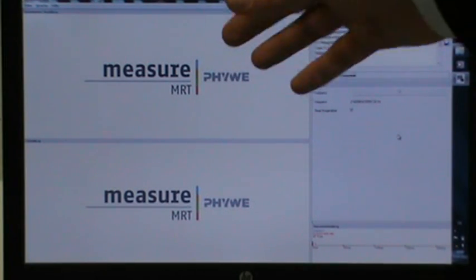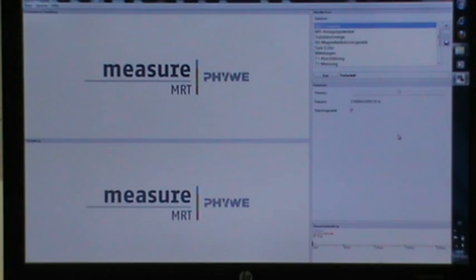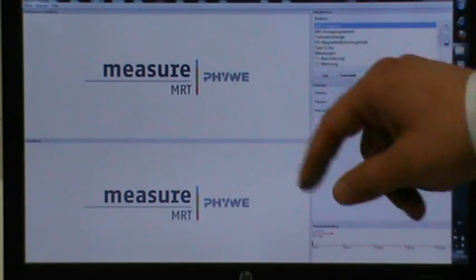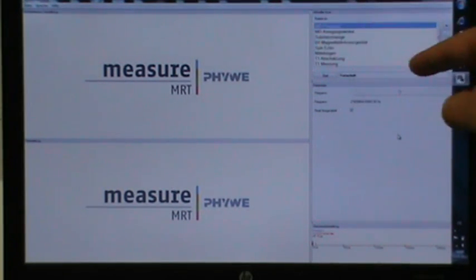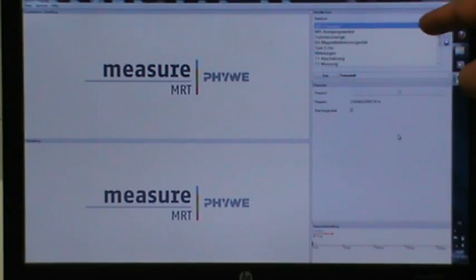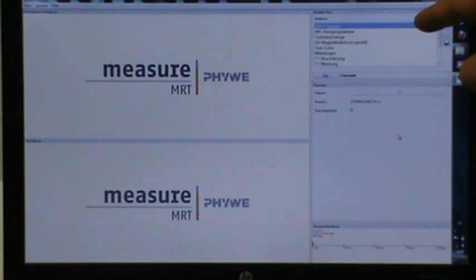The main screen here of the software is divided into four major sections. In the experiment section, you can select the experiment you want to perform in the following session.